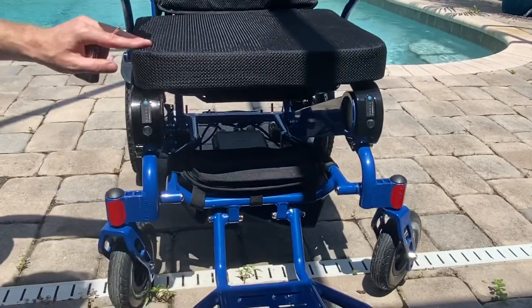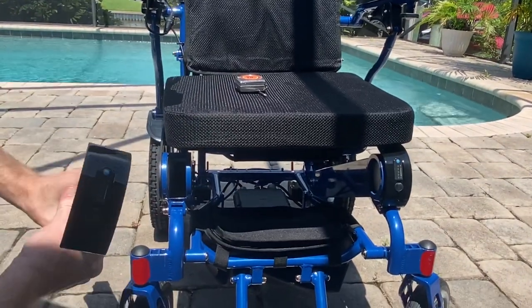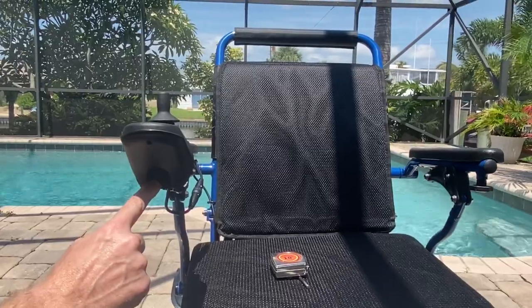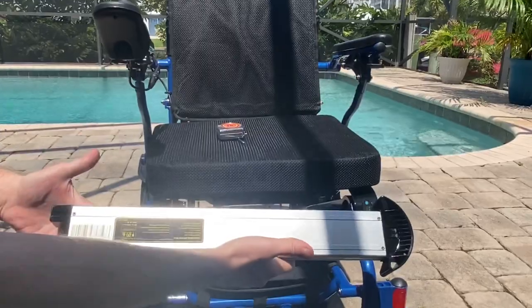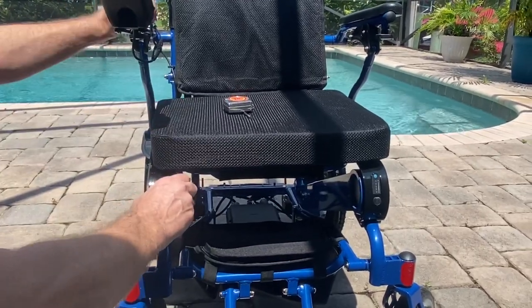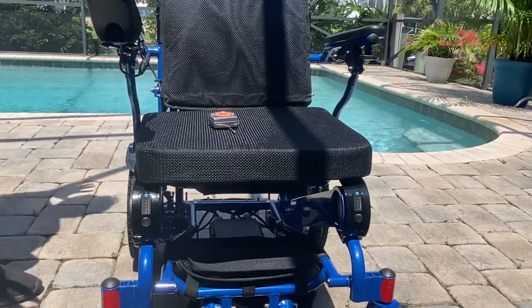The batteries are FAA travel-compliant — they slide right out of the chair. You can charge them directly in the battery, or if you plug the charger into the front of the joystick, you charge both batteries at the same time. Each battery weighs just four pounds and is 6 AH (ampere-hours) per battery, well within travel guidelines. Batteries that are charged properly will last three to five years before needing replacement.